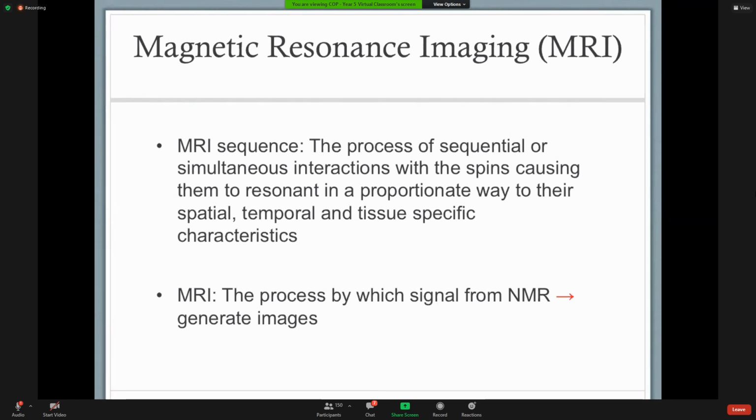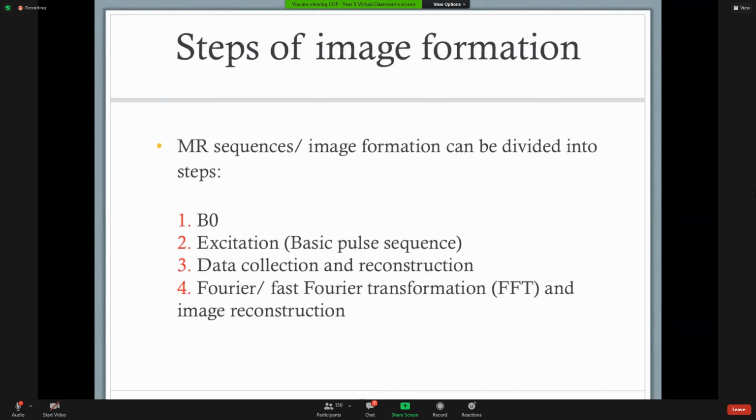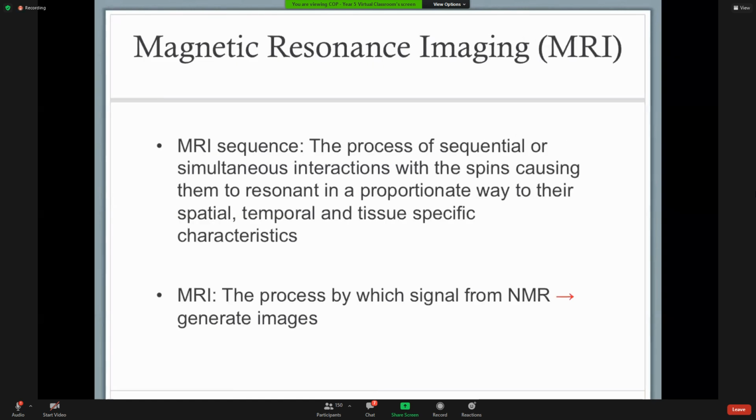And that's why one way to think about the MRI scanner itself is that it is a large magnet which allows the spins to align, and therefore only a small signal will appear, but then multiple coils which are mainly there to transmit, but they could also be used for receiving. And then obviously the resonance part, which is simply a matter of matching radio frequencies.